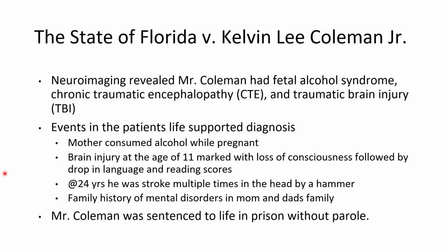So there is a lot to unravel with these cases, but I just wanted to let you guys know that it is an area that's emerging in our field. It's a non-oncologic use of FDG.